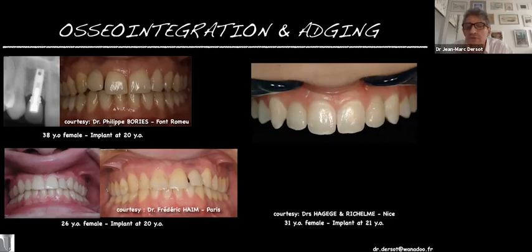Have a look at the upper jaw. This case has been treated by an aesthetic team in the south of France, the city of Nice. As you can see, there are two practitioners. Franck Agej is a friend of mine, a perio, and he inserted two implants because there are two lateral agenesis on both sides. Jean Richelme is a pros, and he put the two crowns. As you can see, the result is wonderful. The perio succeeded in recreating the convexity on the buccal aspect of the implant.